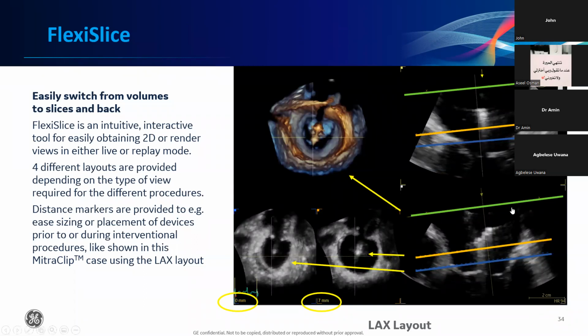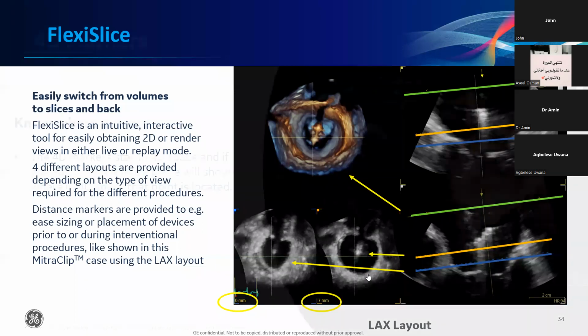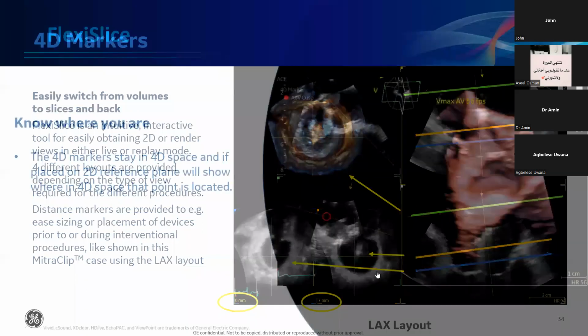set. Another common use actually is utilizing FlexiSlice for mitral valve clip procedures. It's actually now a standard in the protocols of mitral valve clip procedures, where you can have 2 long axis views, 2 short axis views for guidance and assessment during the procedure.